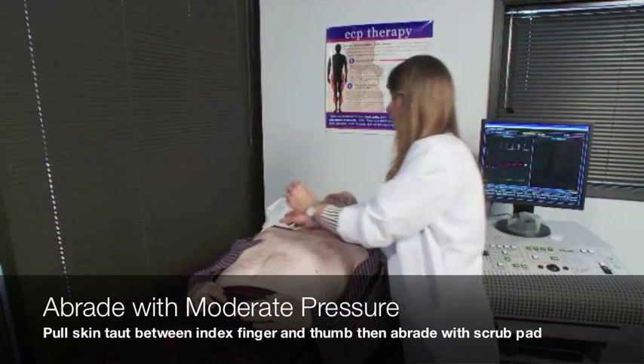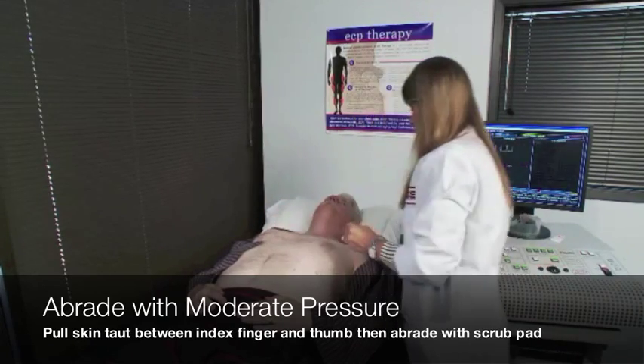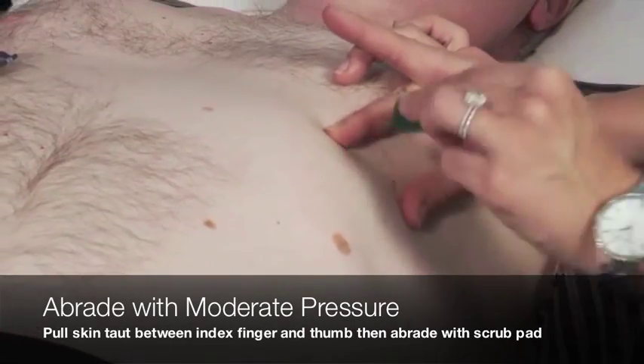Next, take an abrasive prep pad or sandpaper tape and abrade each electrode site. Pull the skin taut between the index finger and thumb and swipe three to four times with moderate pressure in one direction.